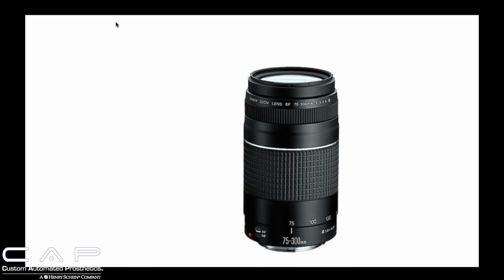This is designed for sports photography or taking a picture of that deer in your backyard or whatever else. It's a great lens, but it's not for what we're trying to do here. Okay, so if you have a zoom lens, that's great, but it's not going to work for intraoral photography.